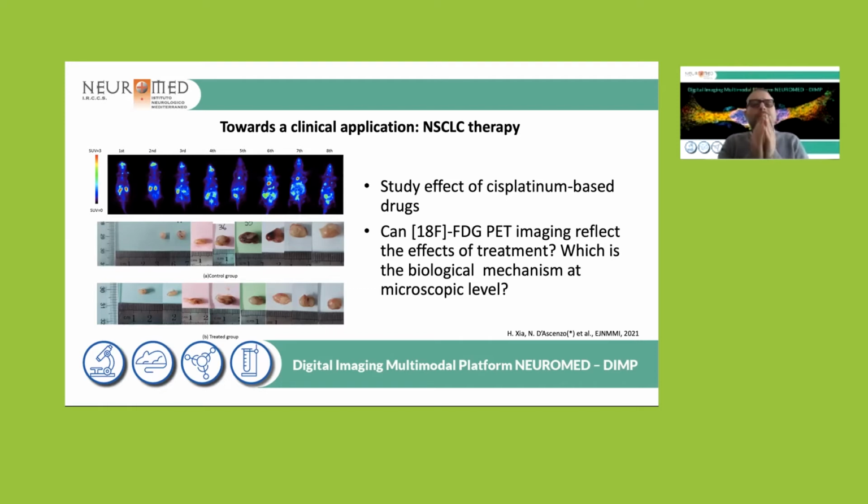We studied the effect of cisplatin-based drugs, and the question was whether PET imaging could reflect the effects of the treatment, and what the biological mechanism at microscopic level is which brings us to observe specific features in PET imaging telling us if we are curing the cancer well or not.